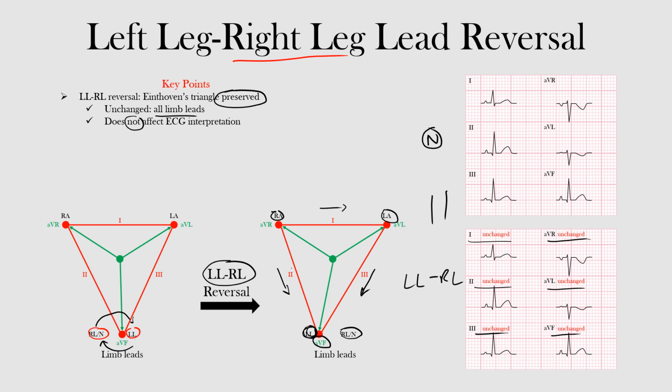Well, that's the end of this lecture. We discussed left leg, right leg lead reversal, and how to identify it on the EKG. I hope you learned something.